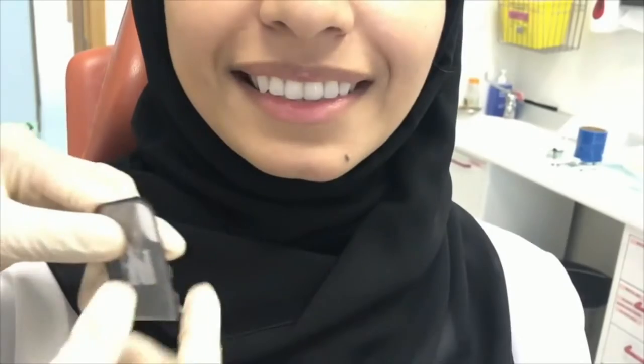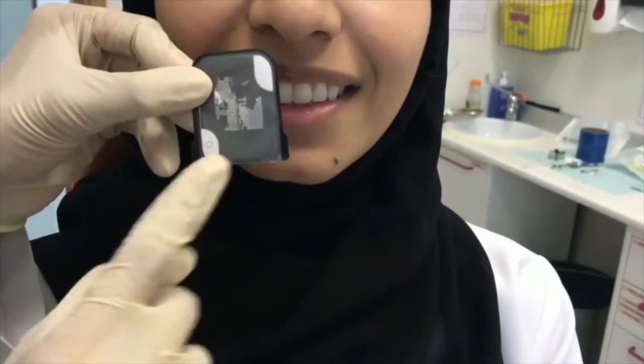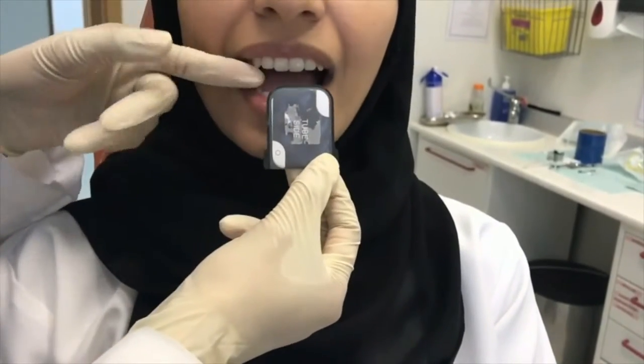The patient's head should be supported against the headrest. Place the film behind the teeth in question. The marker or dot should be placed 2 mm beyond the incisal edges.